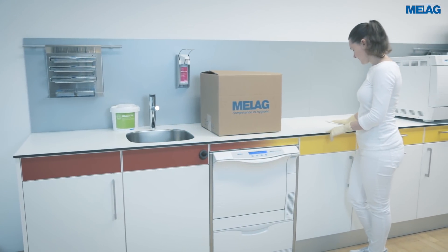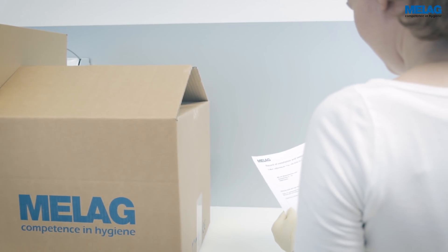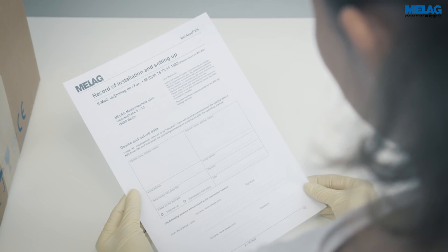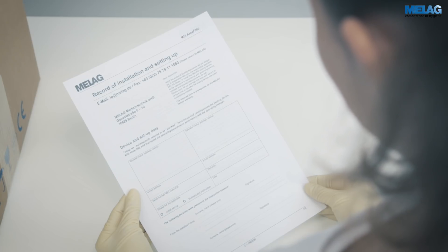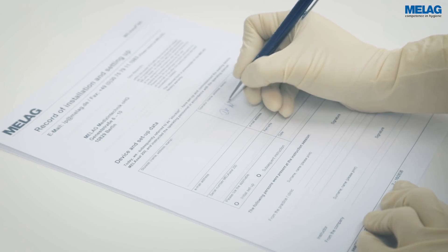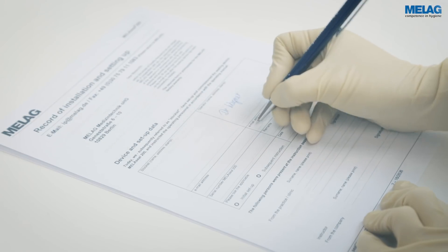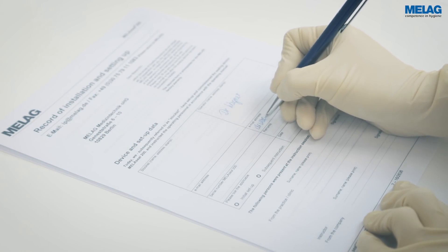The MELAseal 200 tutorial provides assistance with the installation and setup of the sealing device. Record the correct commissioning of the MELAseal 200 with the document included in the scope of delivery. Please complete and sign the installation protocol and return it to MELAG. The completed protocol is a requirement for the MELAG warranty.